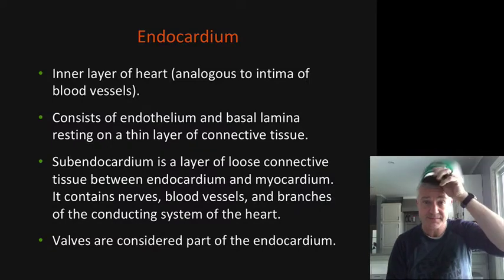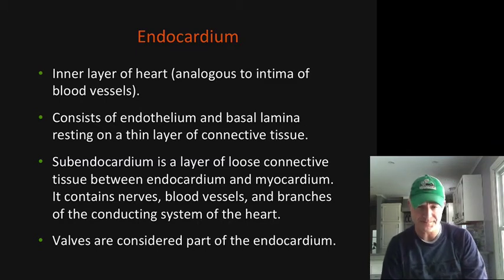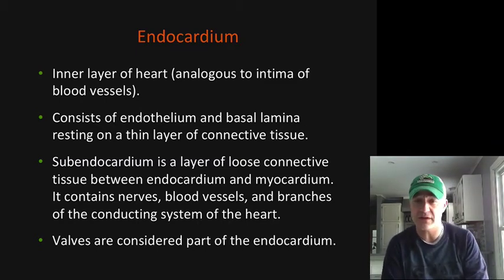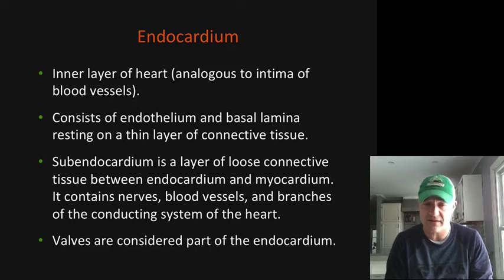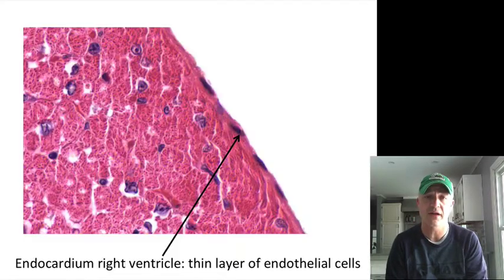So endocardium, this is kind of like the endothelium that you'd see on the blood vessels here. So it's that simple squamous epithelium with a thin layer of connective tissue underneath. It's a little bit of areolar underneath there. Like I said, it's going to have some nerves, blood vessels. One of the things we see is a lot of blood vessels in the heart. Valves are generally considered to be part of that endocardium. They are lined with that simple squamous epithelium on the outside of them.